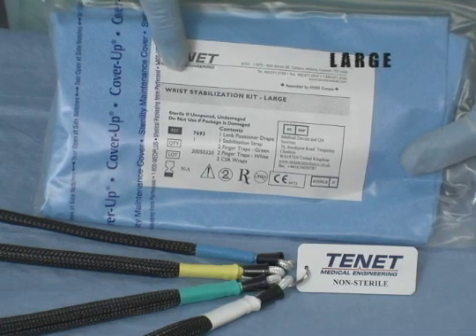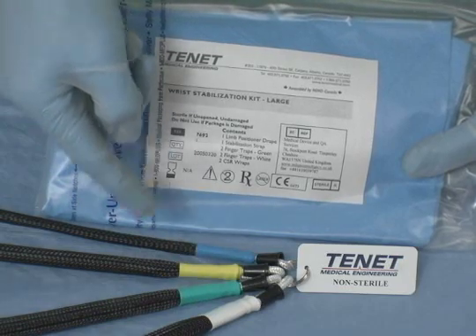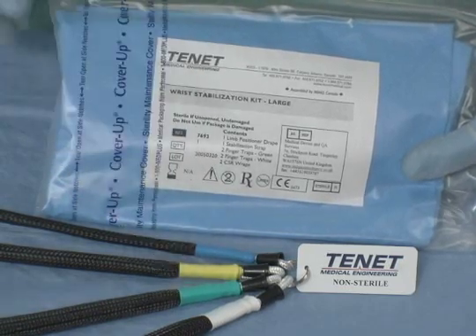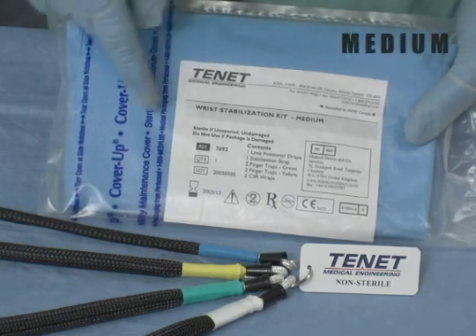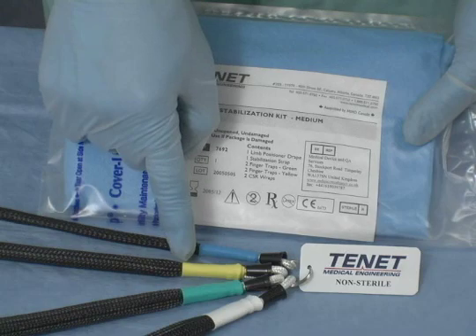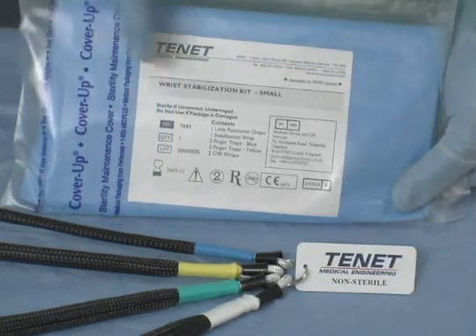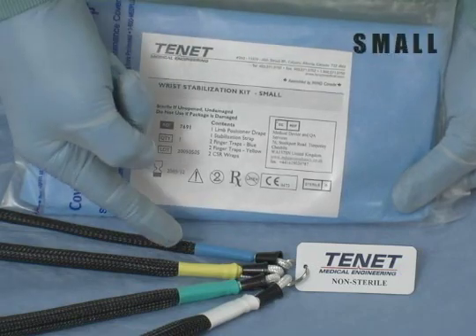The large wrist stabilisation kit has two white and two green finger traps. The medium wrist stabilisation kit has two green and two yellow finger traps. The small wrist stabilisation kit has two yellow and two blue finger traps.